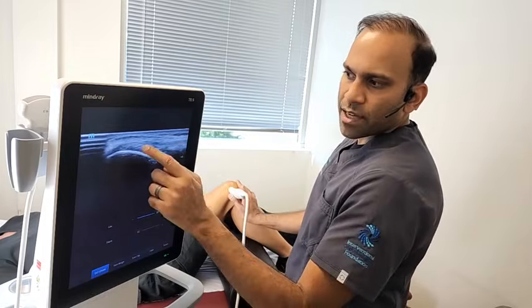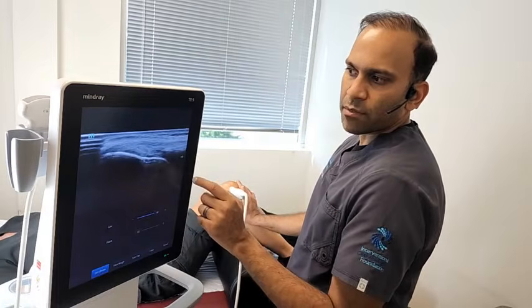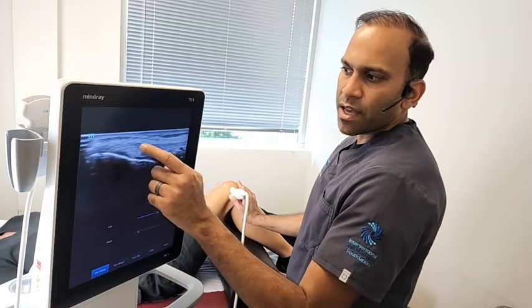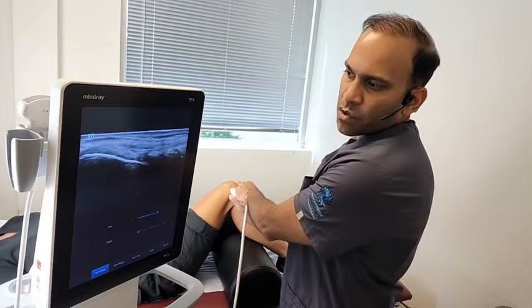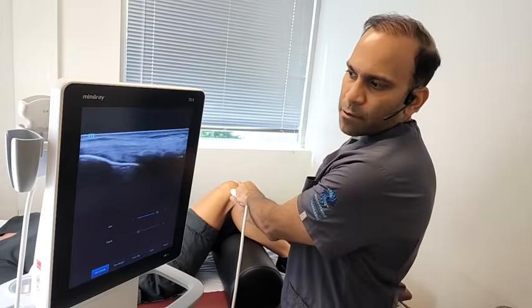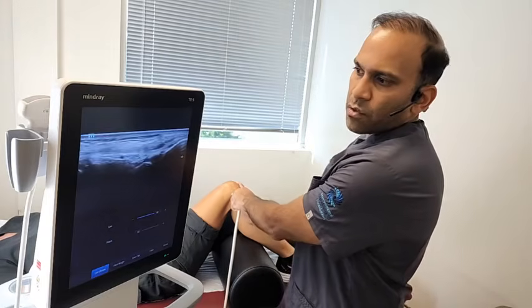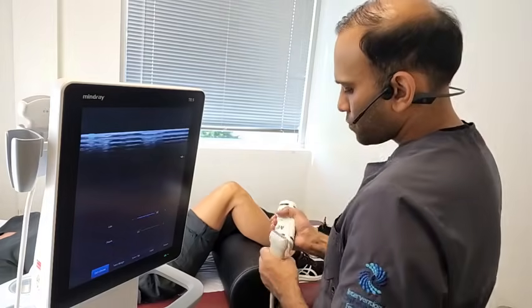So this line now that we have going across is the LCL, or lateral collateral ligament. This is one of the major stabilizing ligaments of the knee, and it's on the outside of the knee. This guy can get sprained in certain situations. It goes all the way down and attaches onto the fibula, which is a part of the lower leg right here. Let me get some more gel here.